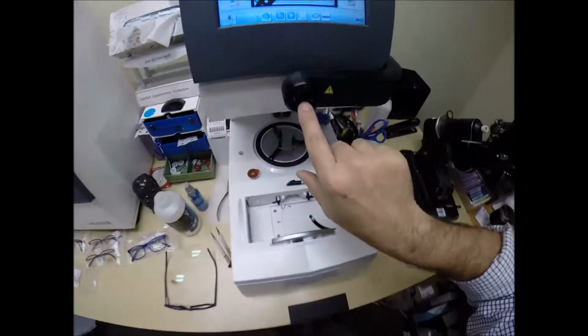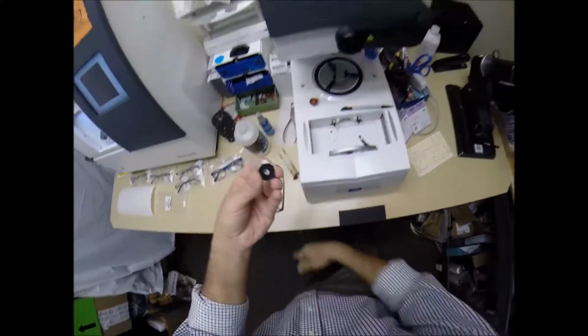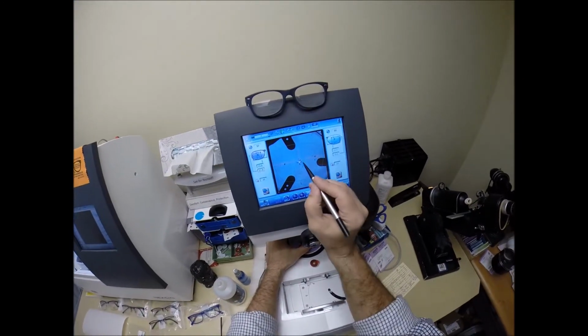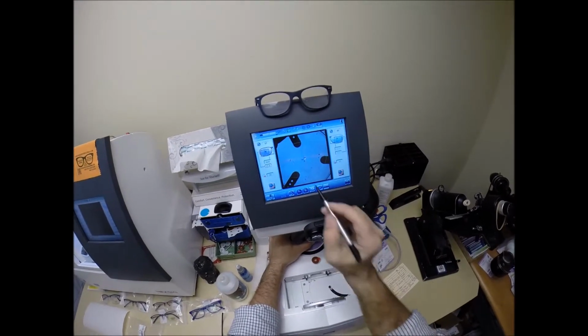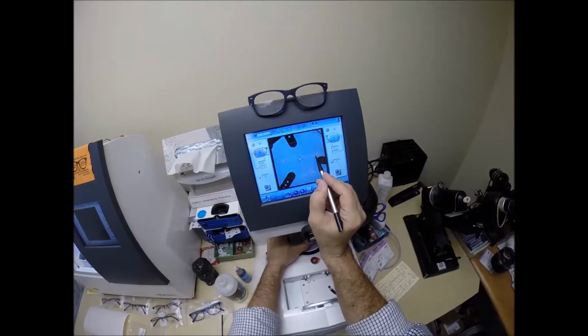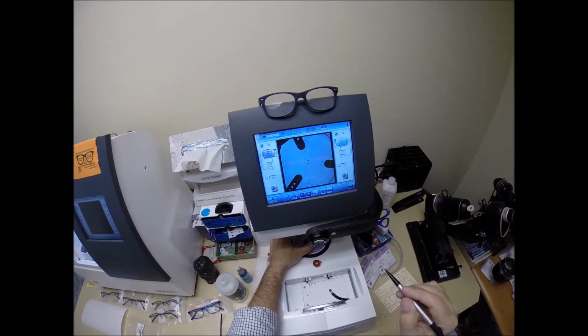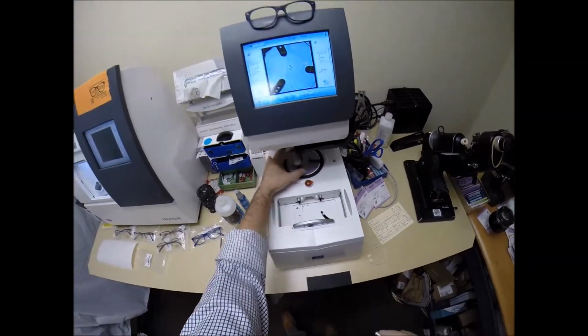The first time it's going to attach itself to another magnet here in the arm. I'm going to pull the paper away to make the black side sticky. Line up the magnets. And this is, your pupil is just above the geometric center of the frame. These other 2 dots tell me that it's lined up in there, so I'm in the crosshairs of a scope. To make your prescription perfect, hit that button. The arm's going to come down and place the block onto the right lens.